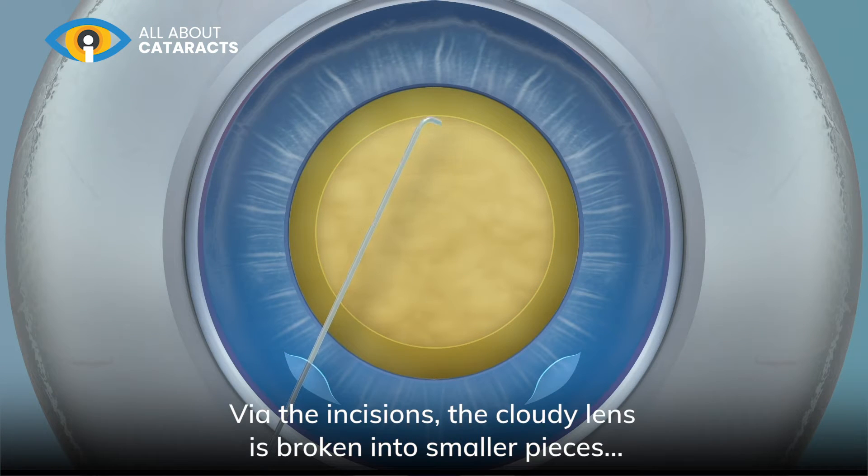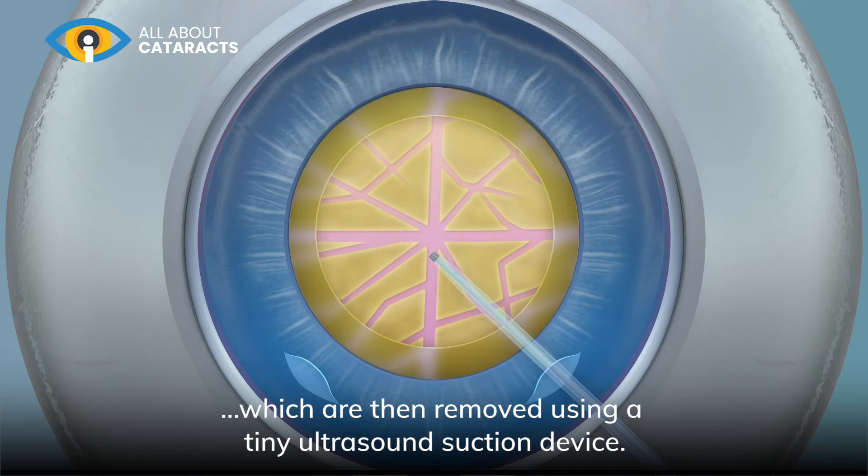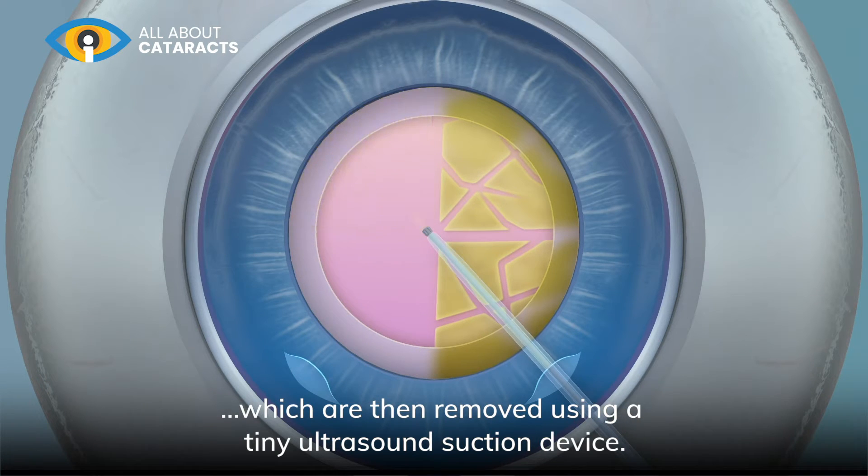Via the incisions, the cloudy lens is broken into smaller pieces, which are then removed using a tiny ultrasound suction device.